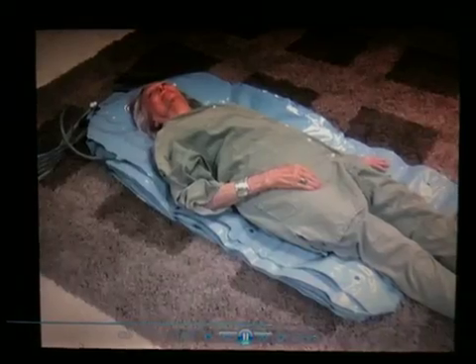The slide sheet is composed of slit double layers. To remove the slide sheet, simply pull on the lower level of the double-layered sheet. The caregiver should be careful not to remove the sheet abruptly.